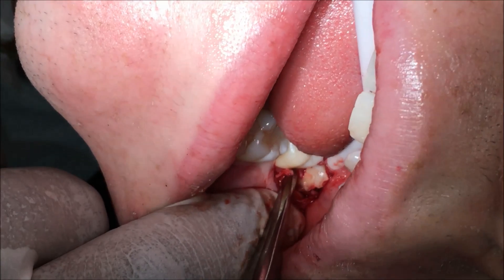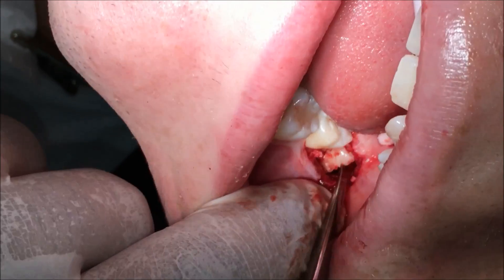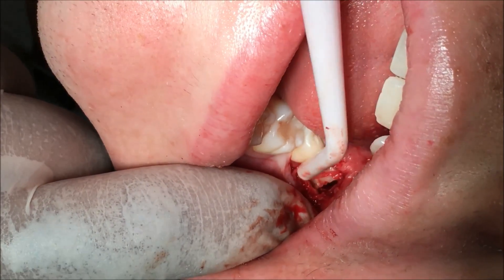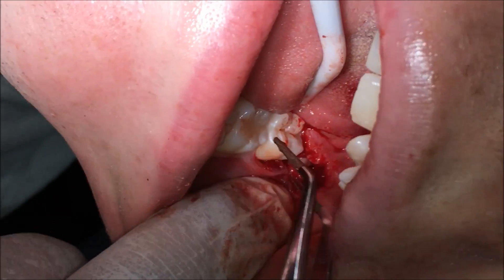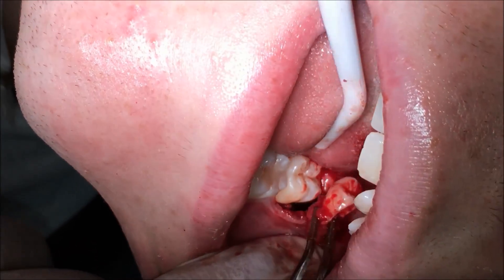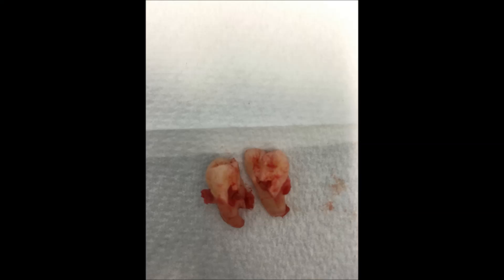We just pop the luxator in the mesial and get it up. With this one I'll use diamond-tipped tweezers to ensure good grip — others like to use an artery forcep — and that's just to deliver that mesial root. Excellent! Here are the sectioned roots. Thank you very much!